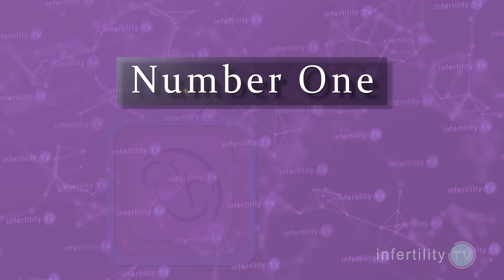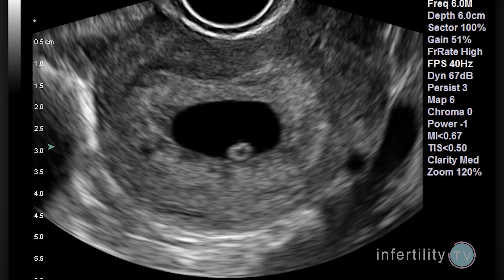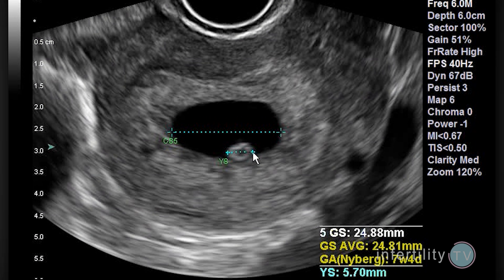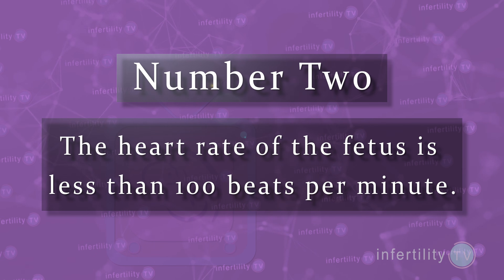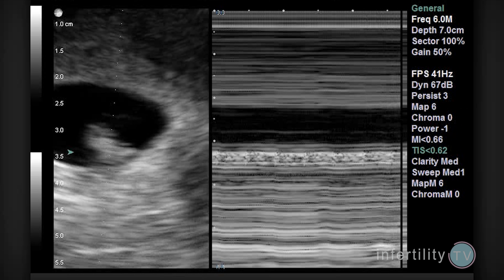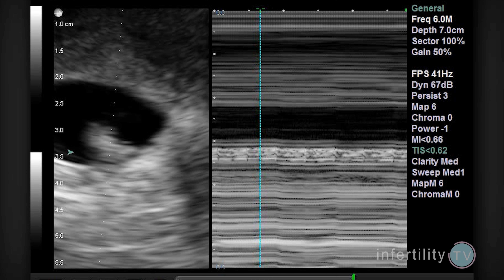The same applies if you don't see a heartbeat but the fetus is only measuring 5 millimeters. There are two other examples to be aware of. Number one: if the yolk sac seems too big compared to the size of the gestational sac — these women are more likely to have a miscarriage but sometimes will go on to deliver. Number two: if the heart rate of the fetus is less than 100 beats per minute. In a healthy pregnancy, the heartbeat is usually faster than that. A heartbeat less than 100 means there is a higher risk for miscarriage, and your doctor will want to keep doing ultrasounds to finally determine if you miscarry or not.